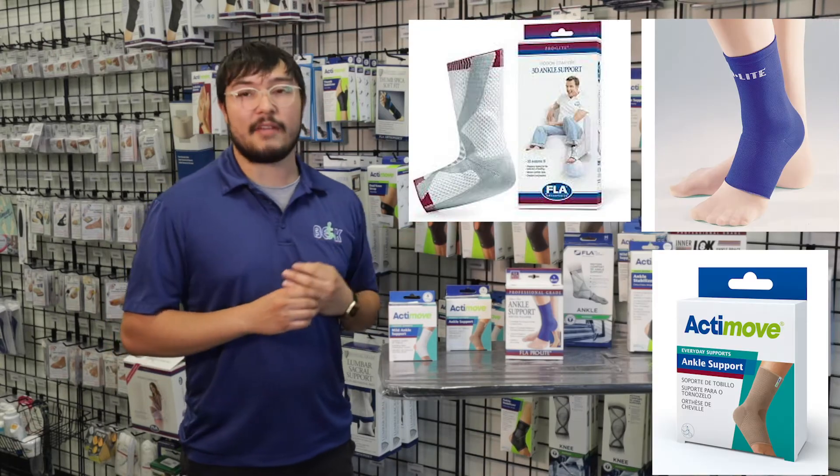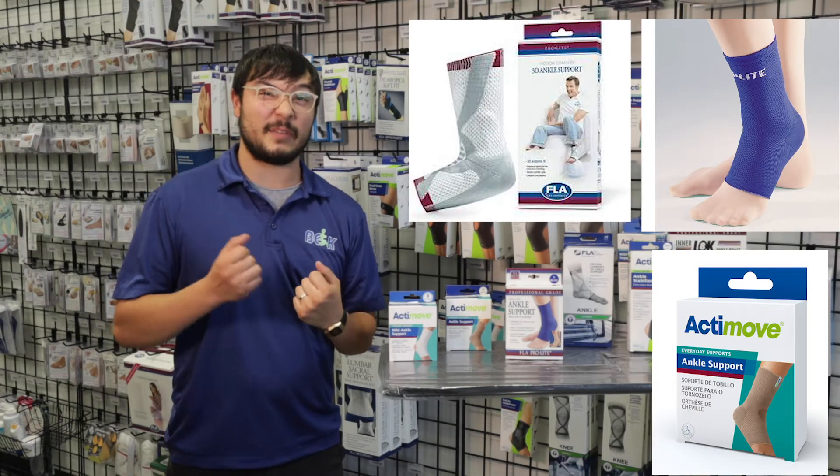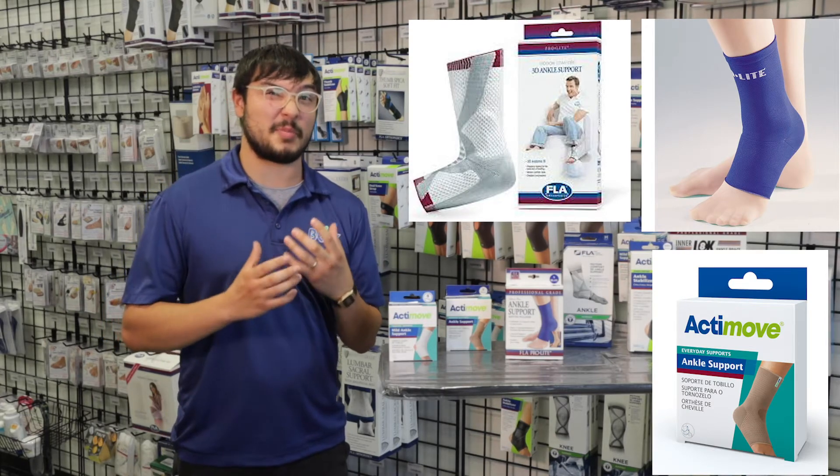Now these three right here have it on so that they can give you a little bit more support, let's say if your ankles are a little bit weaker.